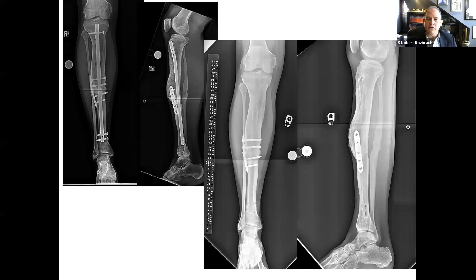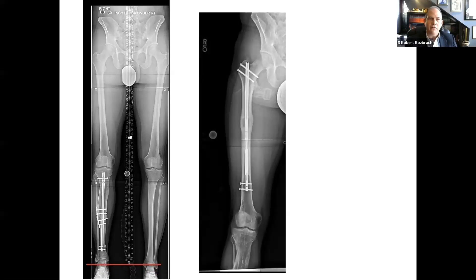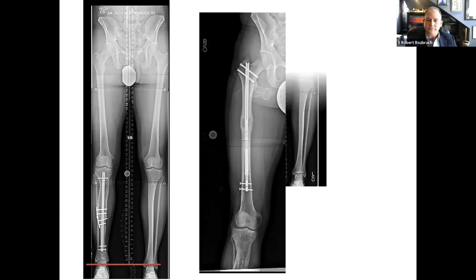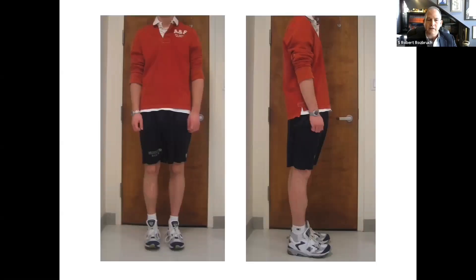These are x-rays a few years later after the intramedullary nail was removed, with the plate left in place. You can see the dramatic reconstruction of the bone that had ensued. Although the patient was doing really well, he did have a persistent leg length discrepancy of about three-quarters of an inch. This was addressed in a staged fashion using an internal lengthening nail in the femur, leading to equalization of the leg lengths. This is Ian when he's all done — equal and fully functional.